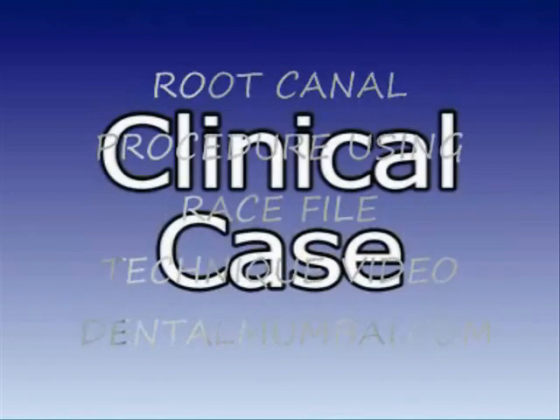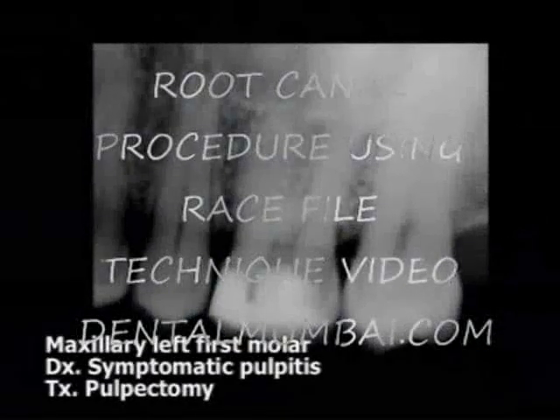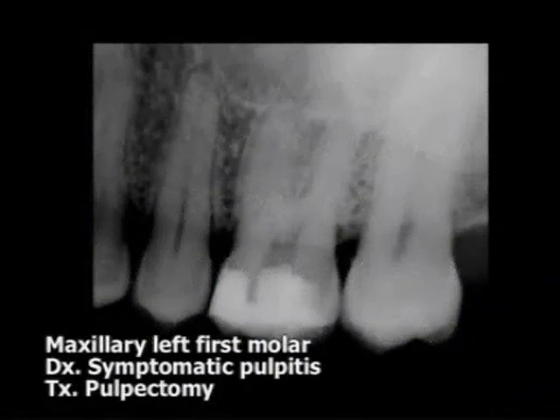We will now use the RACE instruments in endodontic treatment of a patient. The tooth in need of treatment is a maxillary left first molar with the diagnosis of symptomatic pulpitis. The planned treatment is pulpectomy and root filling.